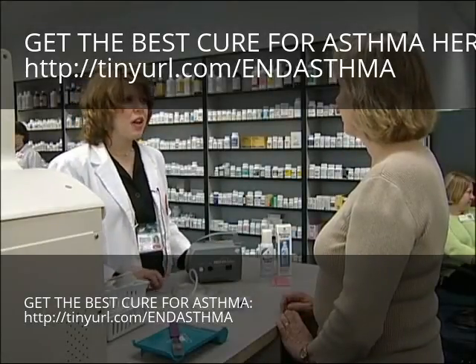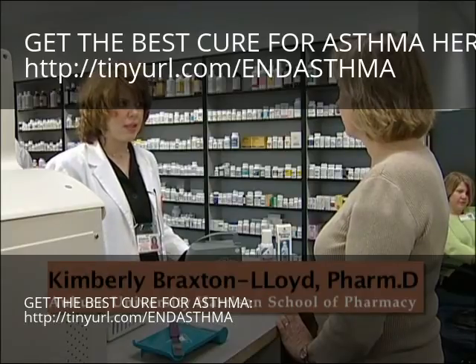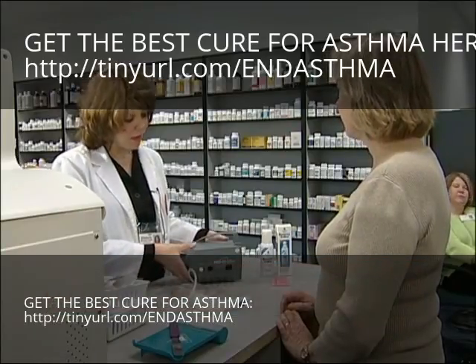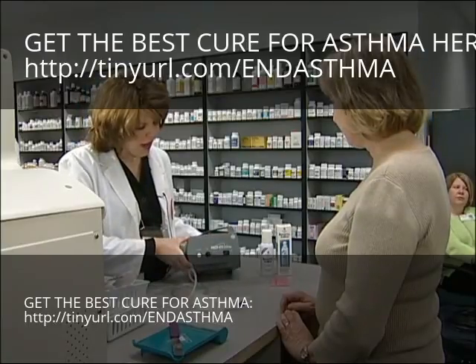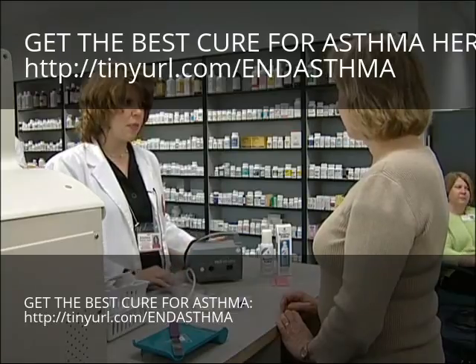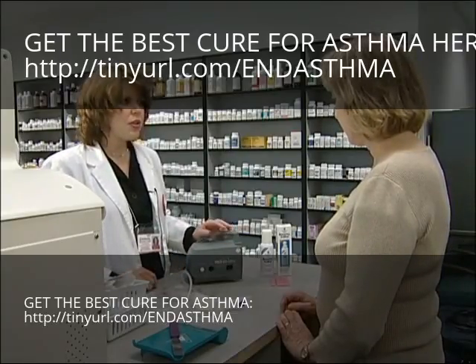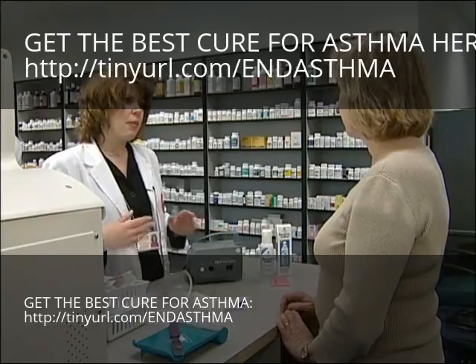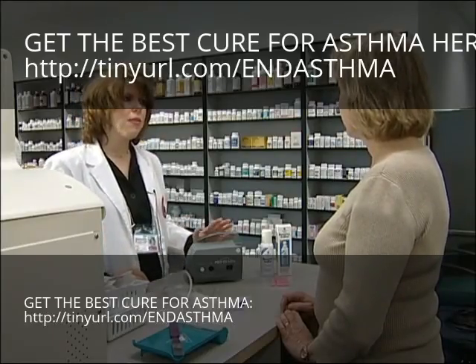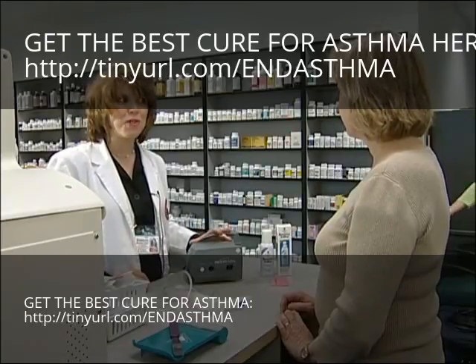Good afternoon. I see that your doctor has written a prescription for you to use a nebulizer at home to deliver your asthma medications. This is a very neat little piece of equipment. The one we're giving you today is the ProNeb Ultra nebulizer and it uses compressed air to deliver your medications. If you used a nebulizer in different settings such as the emergency room, your doctor's office, or a clinic, you might see a different type of instrument, but this one is very compact and can be used at home.